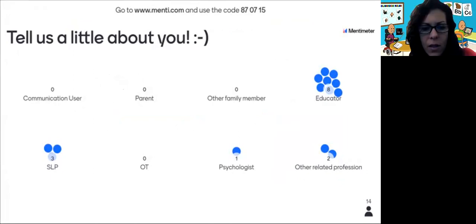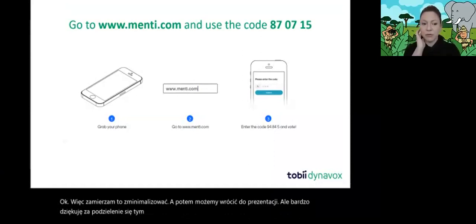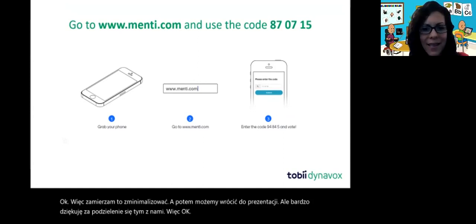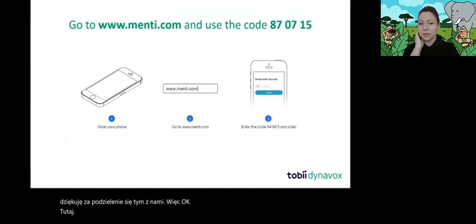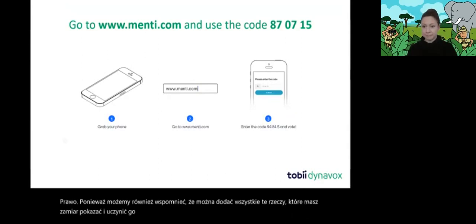Okay, so I am going to minimize that and then we can go back into the presentation, but thank you so much for sharing that with us. Just one comment here. We've got a visual therapist also here. Okay, great. And I think this is super great because we can also mention that you can edit all those things that you are going to show and make it more visual friendly for specific needs.